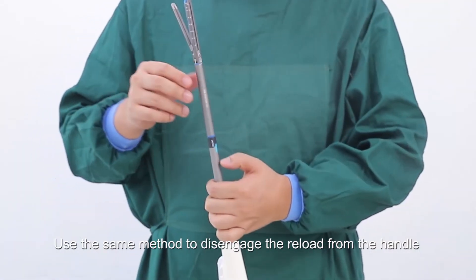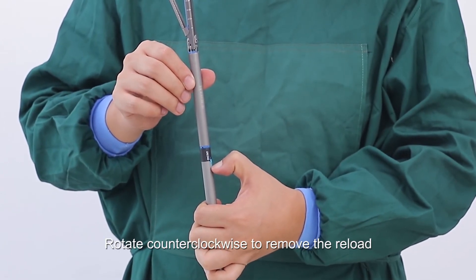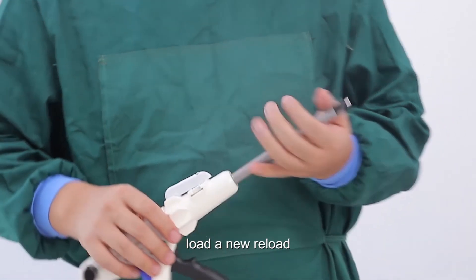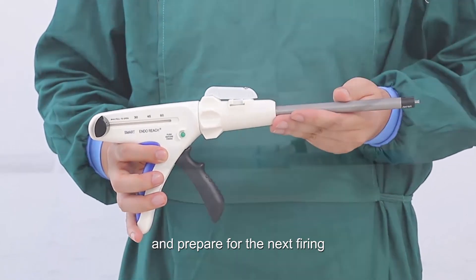Use the same method to disengage the reload from the handle. Rotate counterclockwise to remove the reload. Dispose of the used reload, load a new reload, and repeat the same steps to prepare for the next firing.